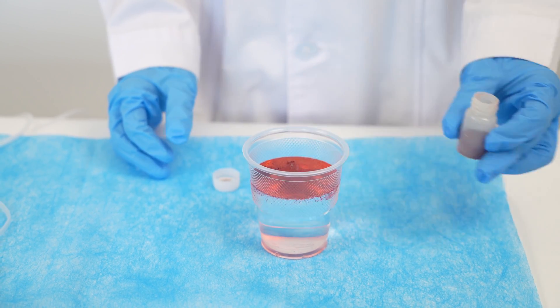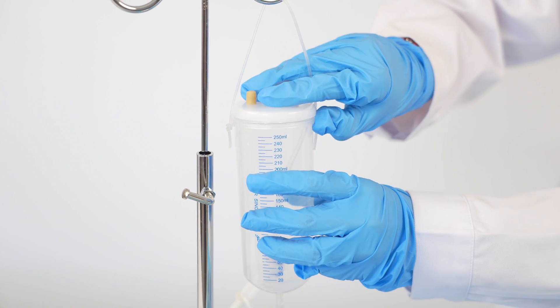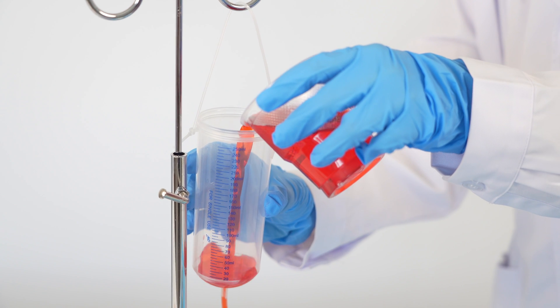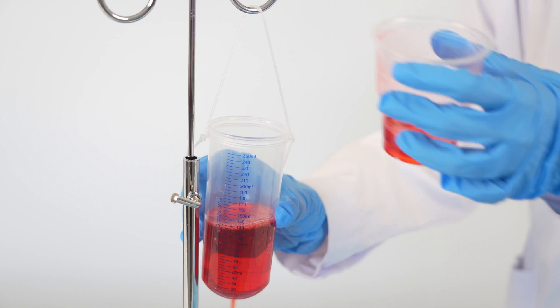To prepare the fake blood, take the red food coloring powder from the general pack into a cup and pour water to mix it. Make sure the outflow roller clamp is closed one more time, then add the mixture to the reservoir container, filling it about two-thirds or three-quarters full.